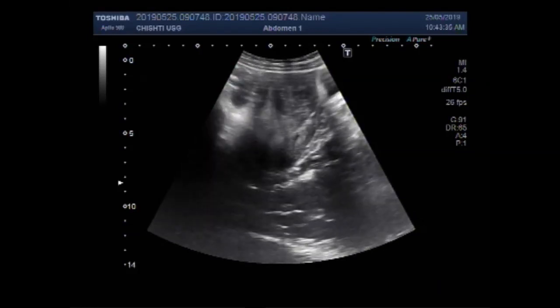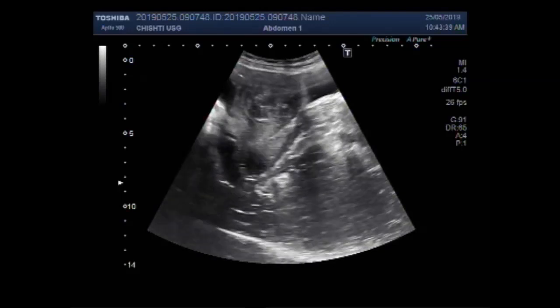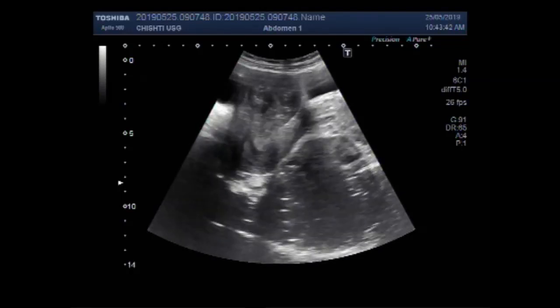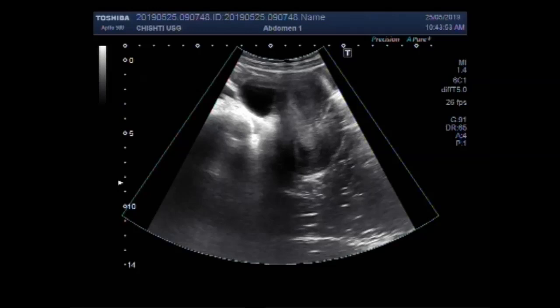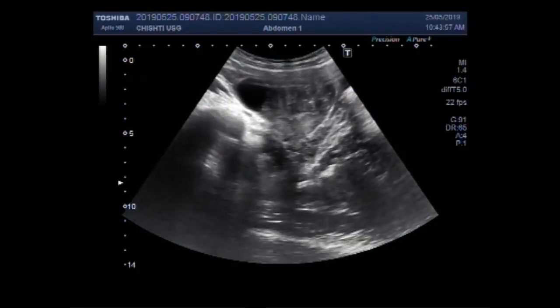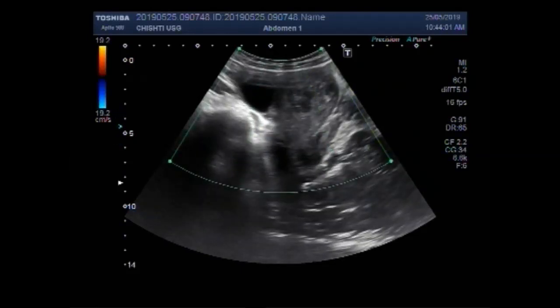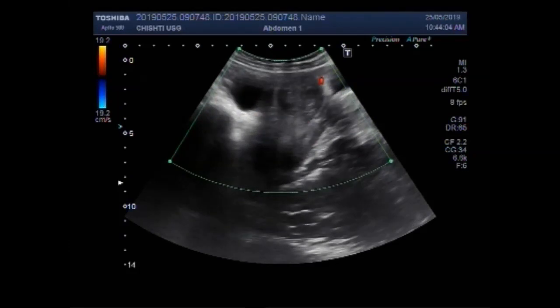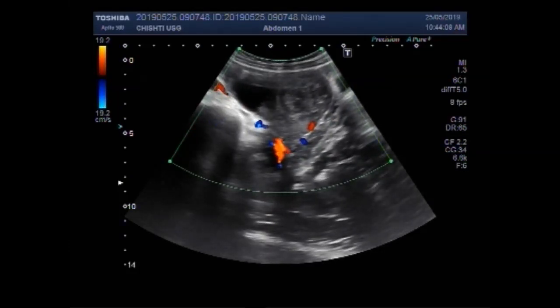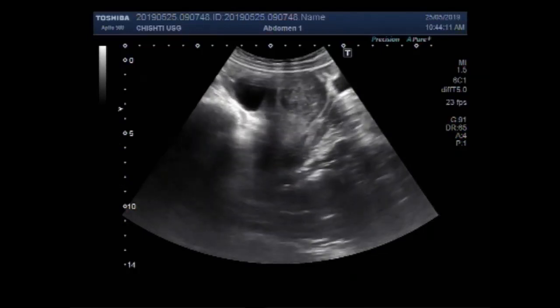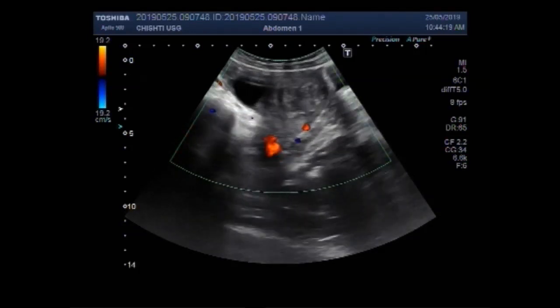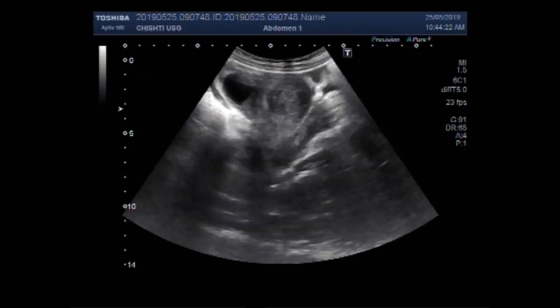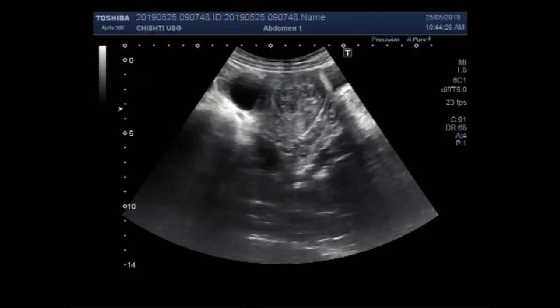Now you can see both the mass and the left ovarian cyst. This mass is also semi-solid to solid in consistency and round to oval in shape. This is the mass and this is the left ovarian cyst. Now you can see the blood flow. The echogenicity of the mass is heterogeneous, with blood flow also seen inside the mass.